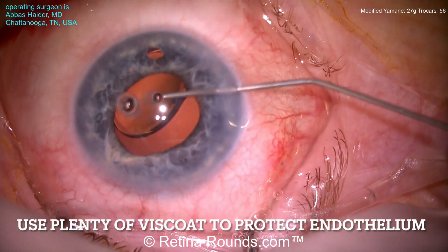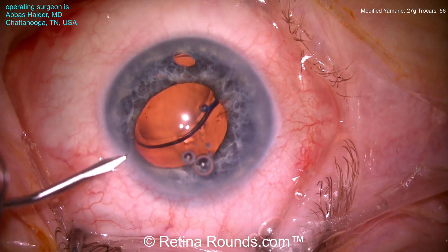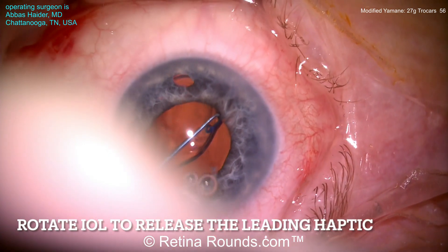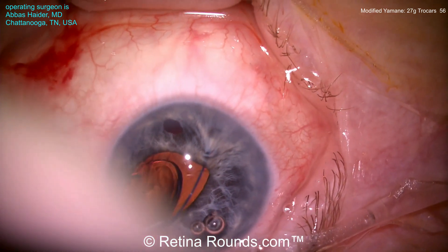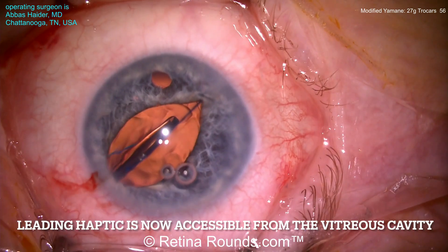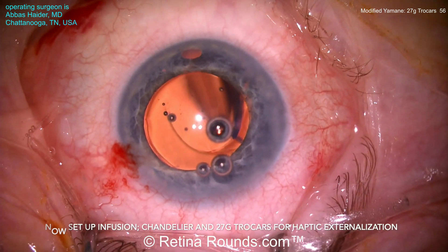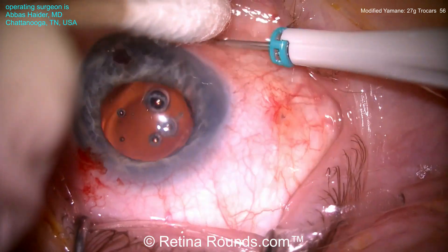Now filling the anterior chamber with some viscoelastic — that's a good idea to protect the endothelium during these maneuvers. An additional paracentesis is being created in the opposite quadrant to try to free up the haptic that's still attached to the iris. You can see that haptic is being rotated so that it is a little bit more mobile. Now the lens is being held still at the iris but sort of dangling down into the vitreous cavity, which will make it easier to externalize the haptic through the trocar that will be placed shortly.